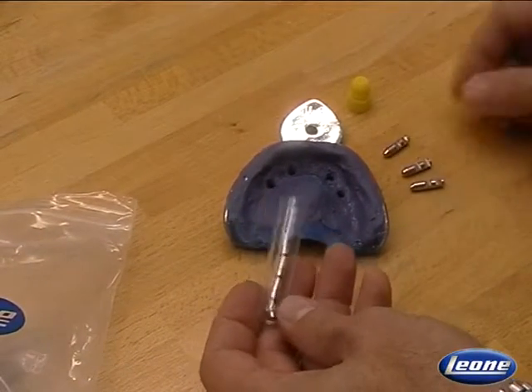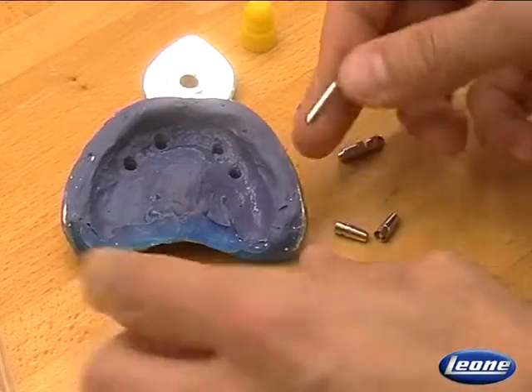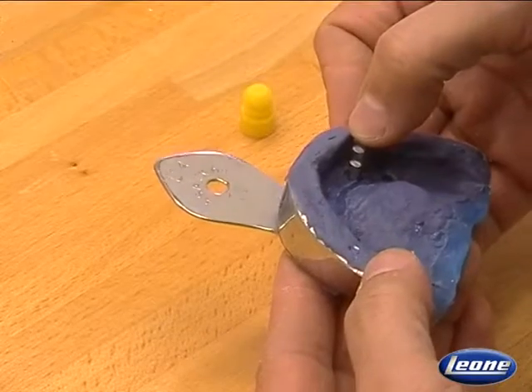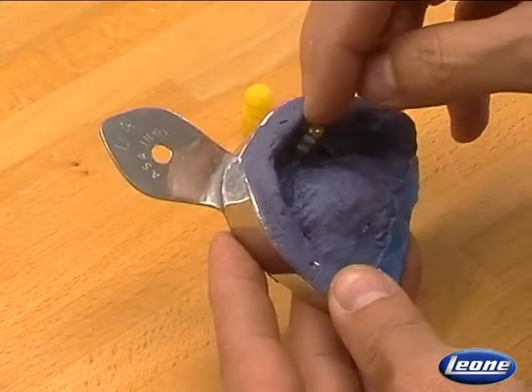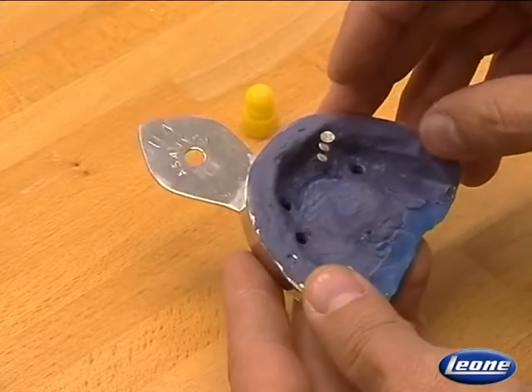I screw the first abutment analog fairly tightly onto the relevant transfer and reposition the assembly into the impression. You can perceive a click when the complete insertion is achieved. Now we have to check if there is enough space between the impression material and the analog. Here it is fine. We have enough space.